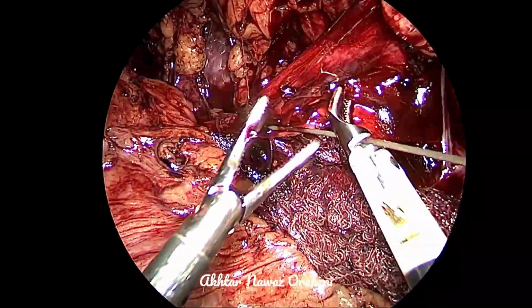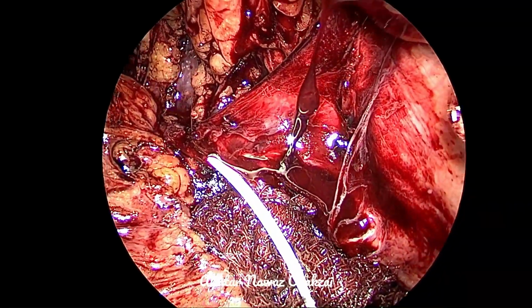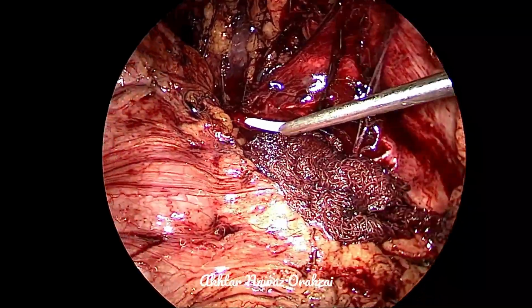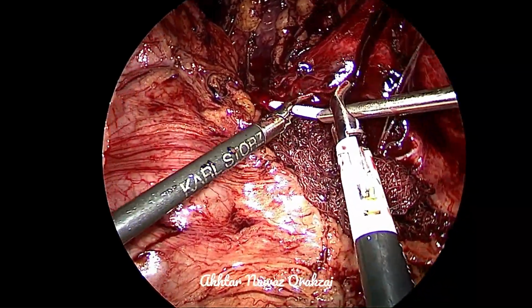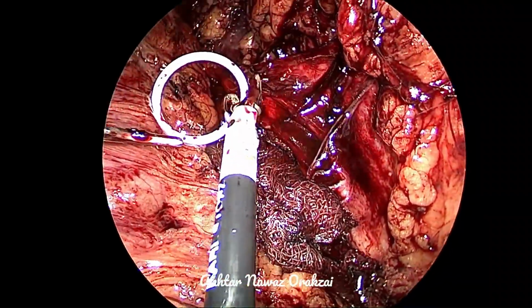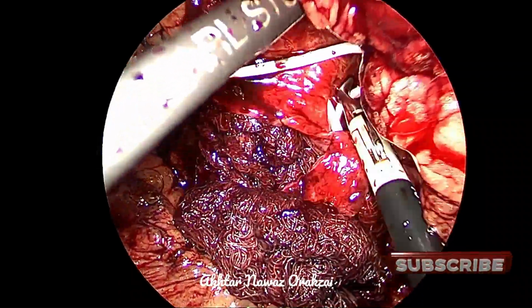So a guide wire is placed into the bladder, and over that guide wire the stent is pushed, and then we push the needle or that 2 millimeter port very near to the PUJ, so that the stent can be pushed easily into the system, and then we take out that port and the guide wire, and we place the loop of the stent inside the renal pelvis.